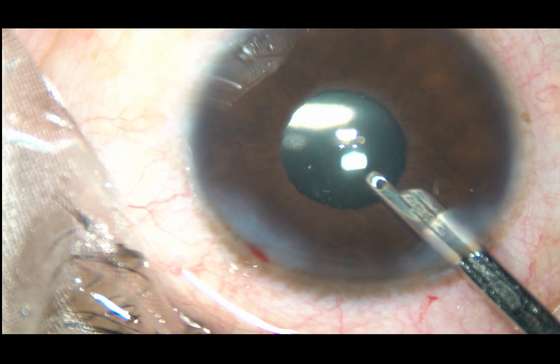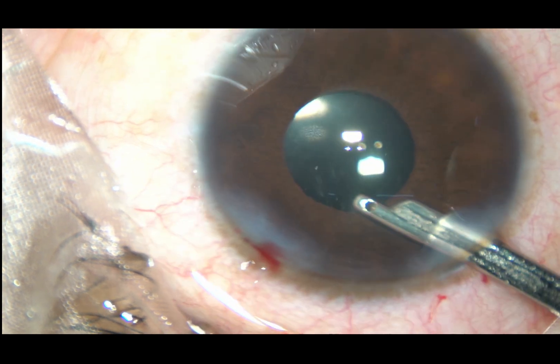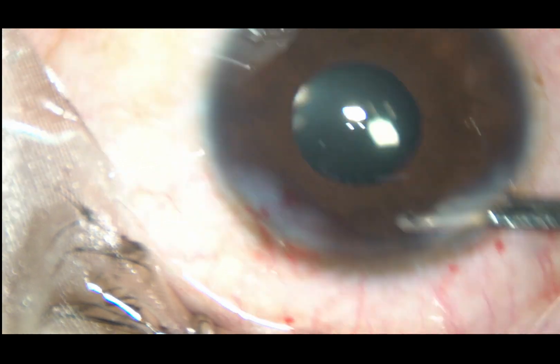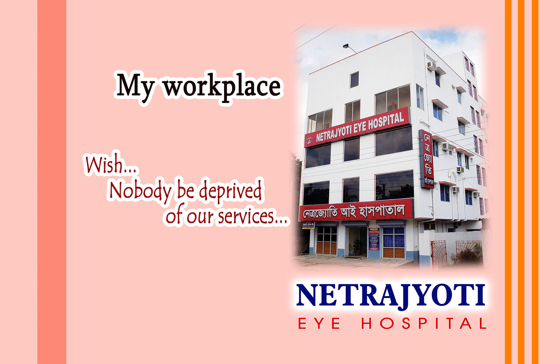Dear colleagues, please get this instrument that looks like a Y — you can check whether you have removed the cortex nicely or not, and whether the lens is in the bag or not. Thank you very much for watching. Hope this video will help you in developing your surgical skills. Please visit my hospital, Nethrujyothi Eye Hospital.